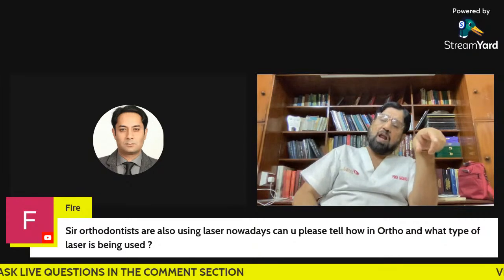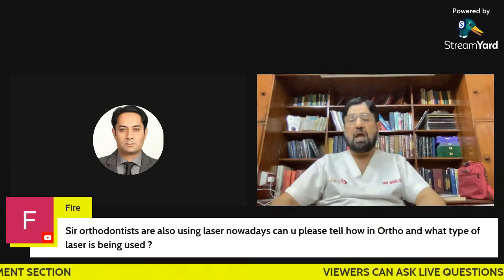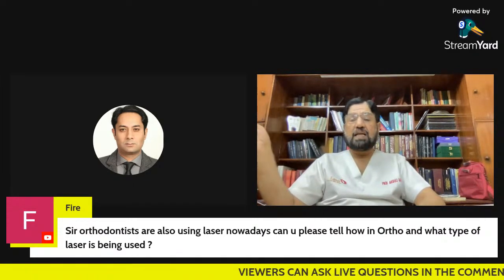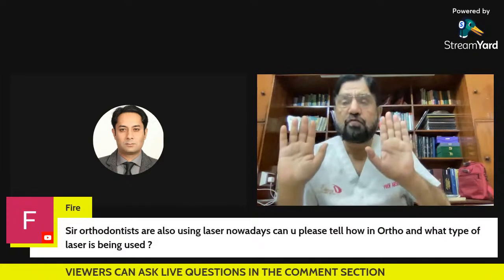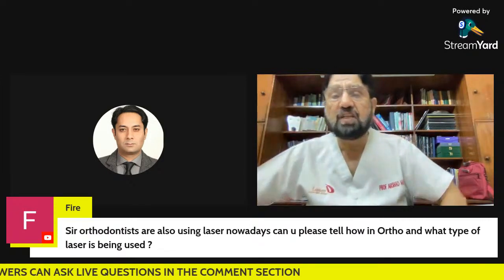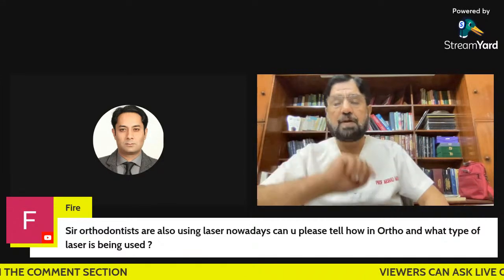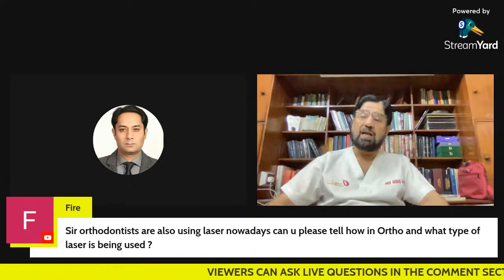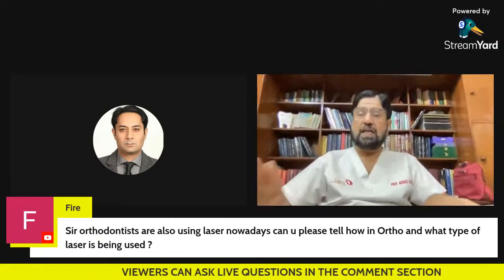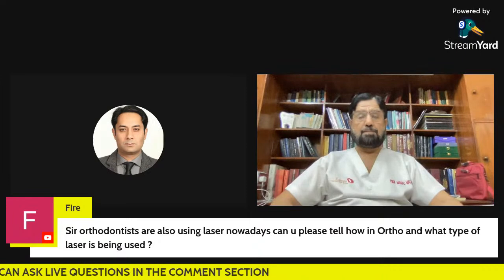Secondly, the fibroblastic activity is more generated by means of the laser. On the opposite side, where there is traction, there is fibroblastic activity, and fibroblasts favor the orthodontic movement in the particular direction where the person is moving the tooth. So these are the miracles of the latest photobioactivation in orthodontic movement. Right, sir.